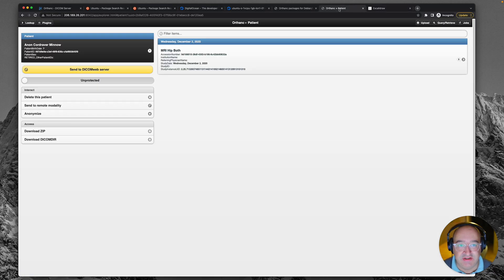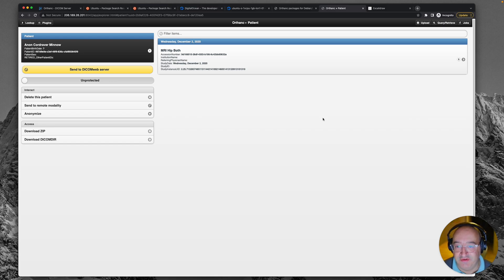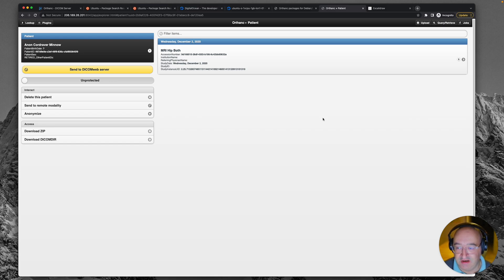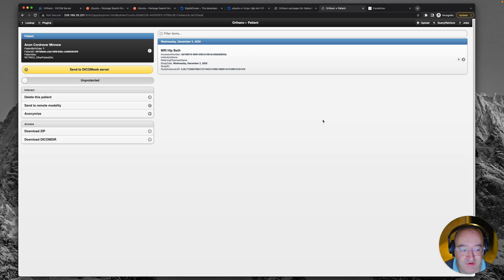So you'll remember last time we got quite far. We got to a point where we had a working server and we could load images into it and store them on the drive. Then we could open them in the web-based viewer and it was pretty satisfying.